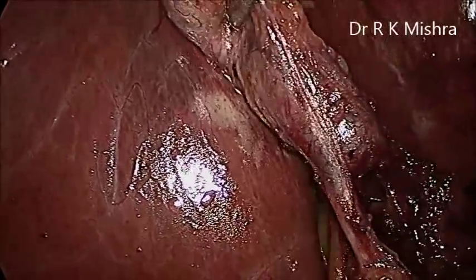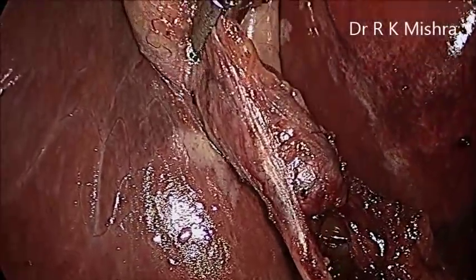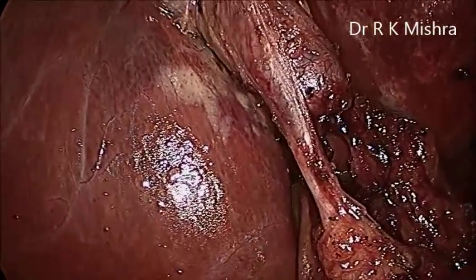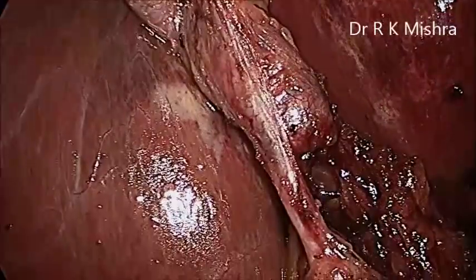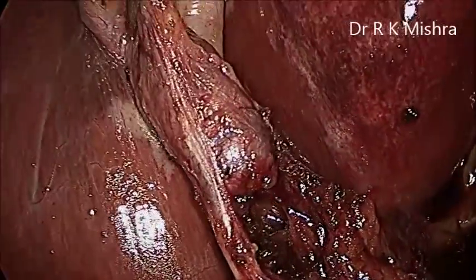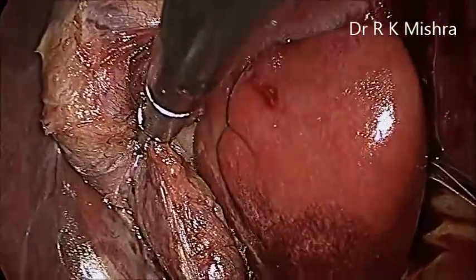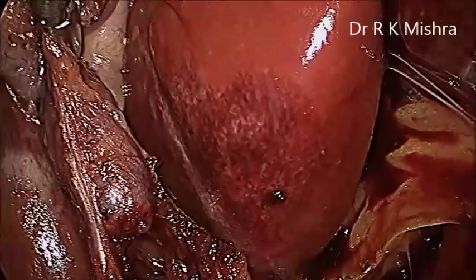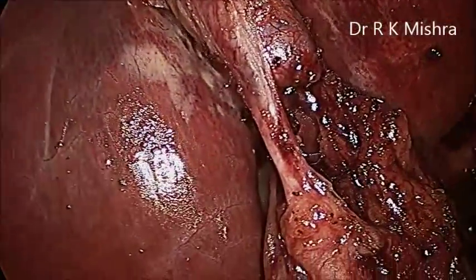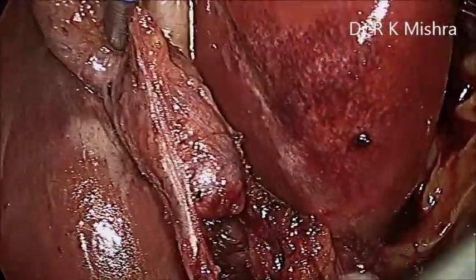Although we can perform the harmonic and the clipless cholecystectomy is also done, in which we don't need to apply any clip or any knot. Even some of the articles that have been published say that the harmonic is safe even if you apply it over the cystic duct. But in my personal choice, at least one knot should be there.